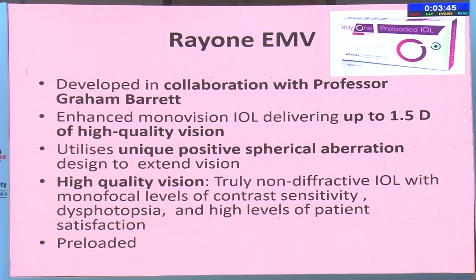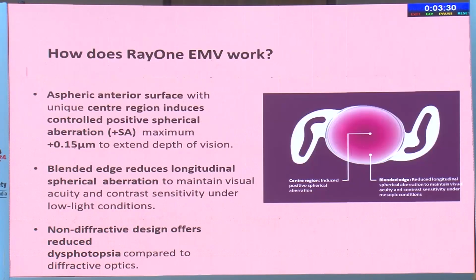It utilizes a unique positive spherical aberration designed to extend the intermediate vision and some amount of the near. At the same time, since it is a non-diffractive IOL, just like monofocal IOLs, there is no night vision problem, and it comes in a beautiful preloaded pack.